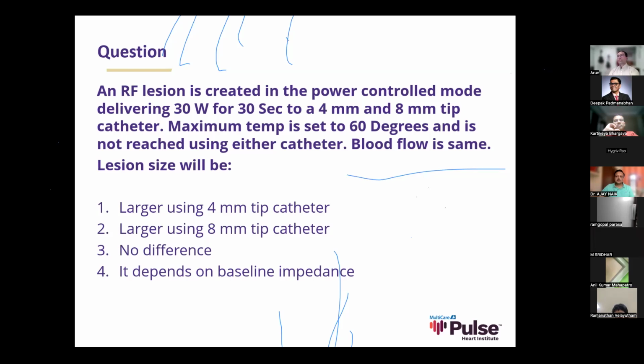One of the other strategies that's been described in some papers is this: usually we put the grounding patch on the leg, right? I don't know how you do it in your lab, but in my lab it's usually on the leg, because we have so many things on the chest: electrodes, a mapping catheter, mapping patches and all that stuff.